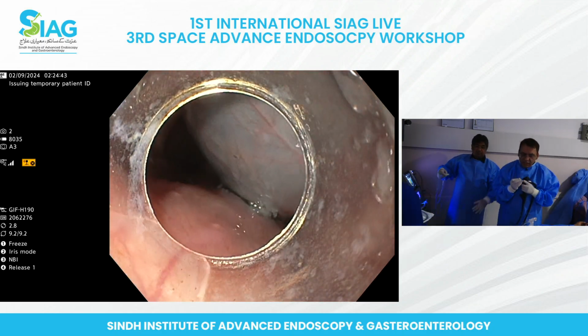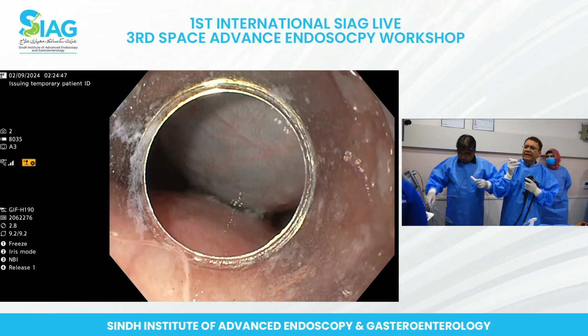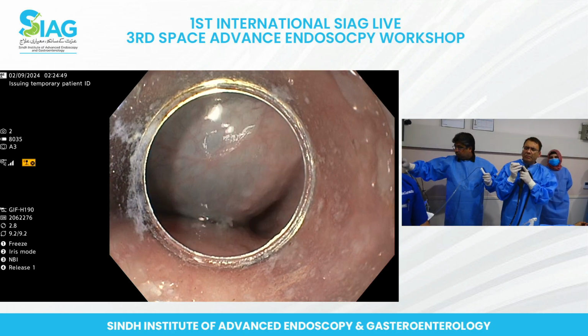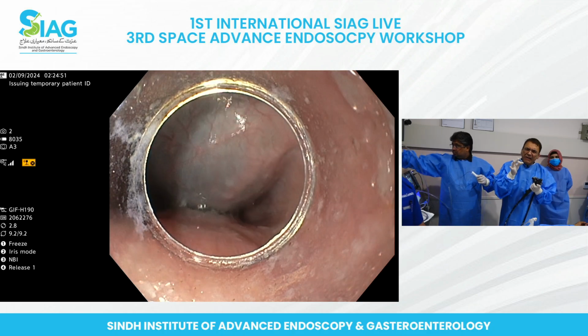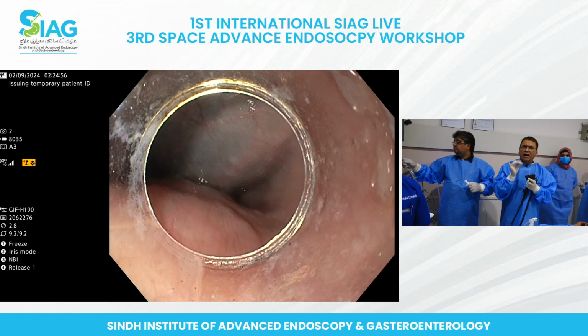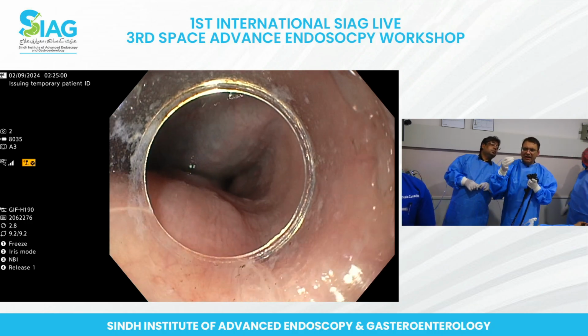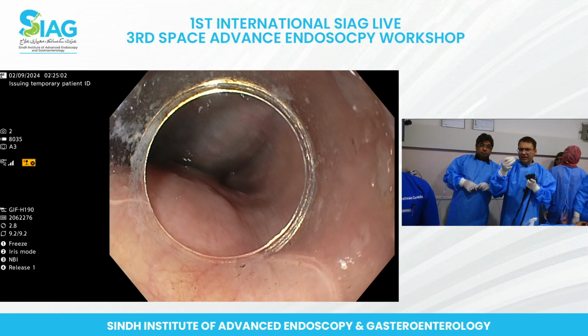Oh, this one. Sorry. So if you look at the knife, I don't know if you can even see that, the knife when it is completely open is almost 5 millimeter or so. So you want to be cognizant of that, how long the knife is.